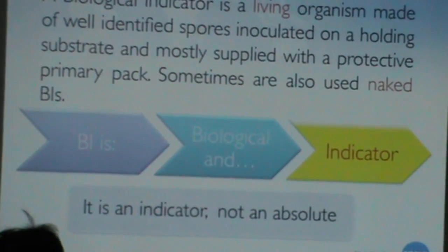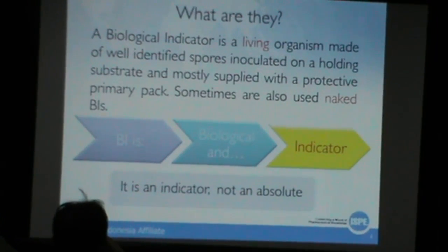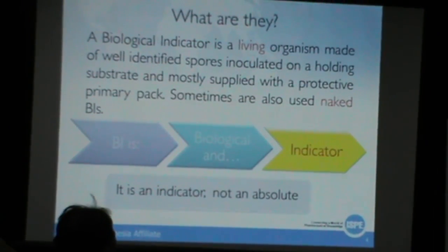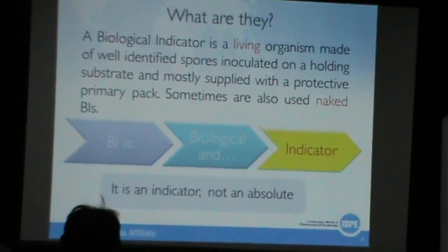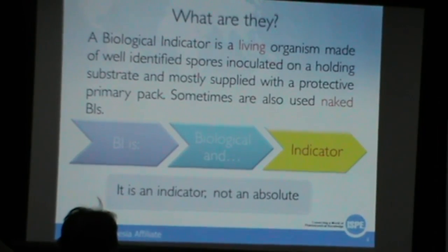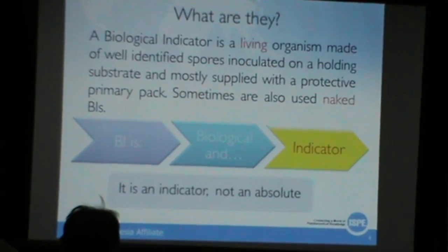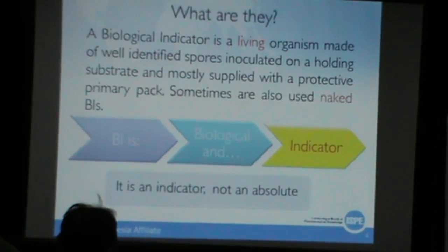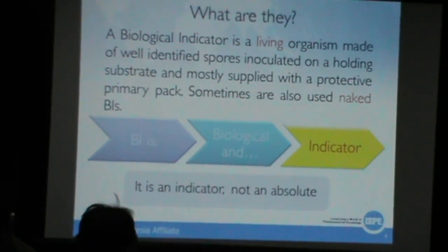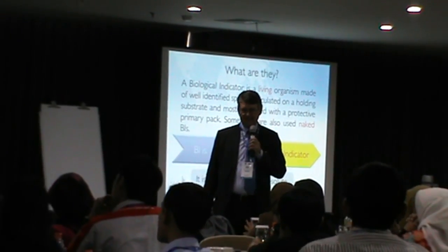First of all, we have to consider that a BI is a living organism. So it is an indicator and it is not an absolute. As it is a living organism, mathematics cannot be applied. We have to apply statistics.